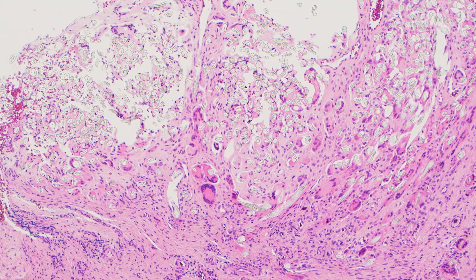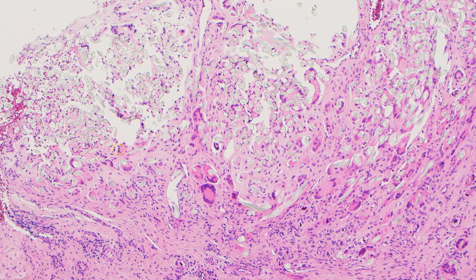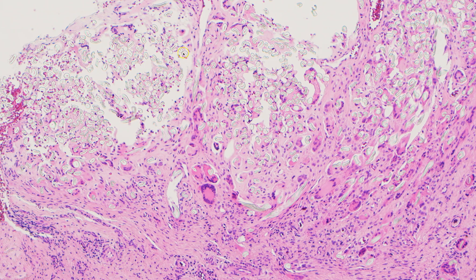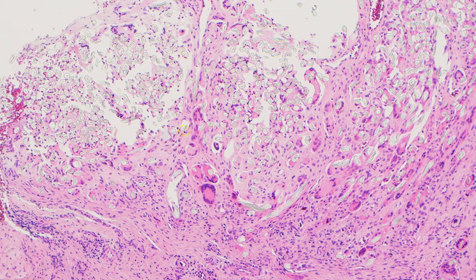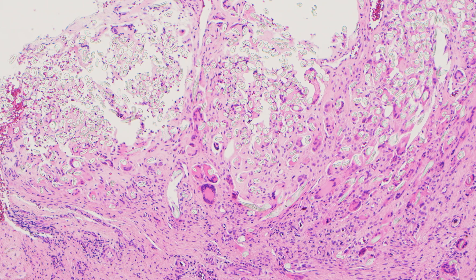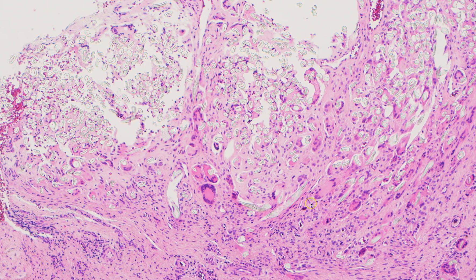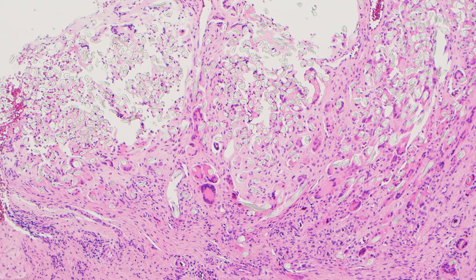This is a great example of the foreign material. What is this material? I'm not 100% sure — I suspect it's actually cotton fibers. These little U-shaped or squished oval shapes, sometimes if you cut them in a different direction you can see they're longitudinal, kind of hollow fibers. They're refractile, pale to clear. And if you use a polarizing filter, they will glow and be birefringent under polarized light examination.